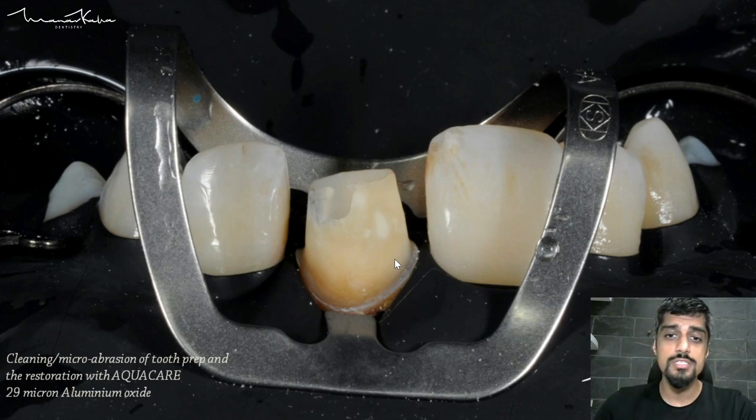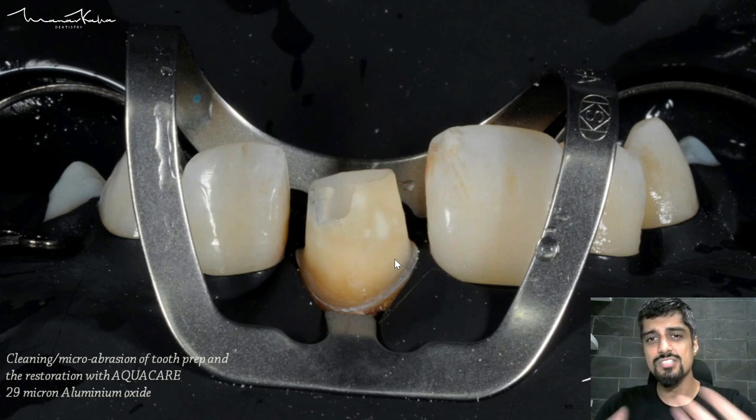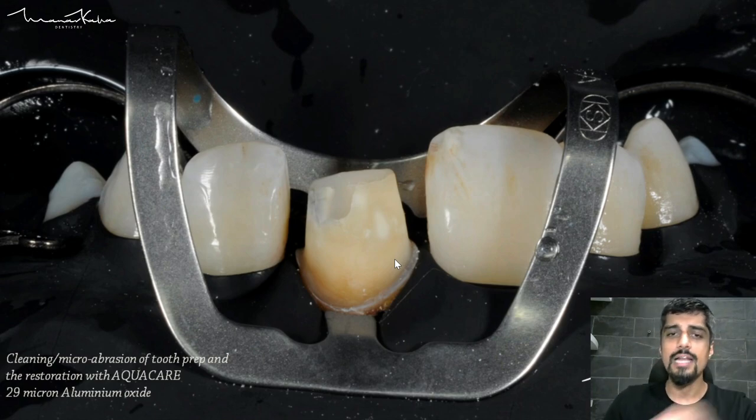Even if you are not using plaque disclosing agents, please use a fluoride-free pumice paste to clean away all the plaque. Why fluoride-free? Because fluoride will interfere in the bonding process in your next step. What I have used — which is an even better option than fluoride-free pumice paste — is AquaCare, using 29-micron aluminium oxide and blasting it away. Even before I etch the tooth, the tooth looks etched. You can see how clean it is — it has a matte appearance.